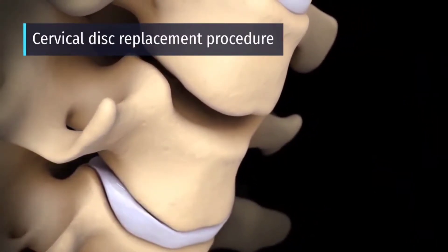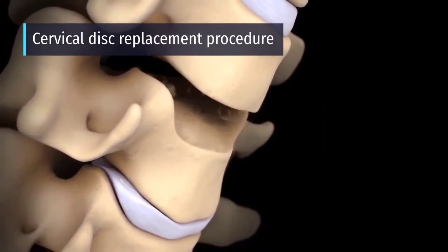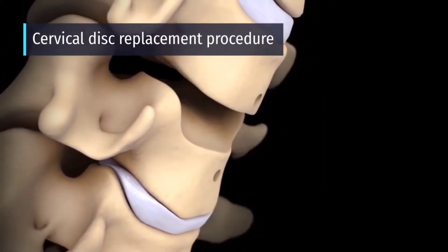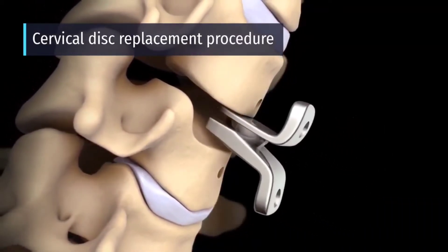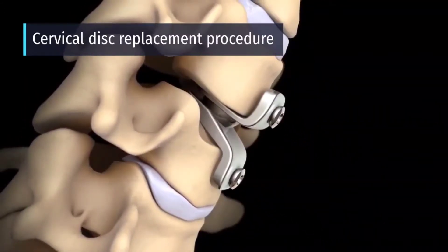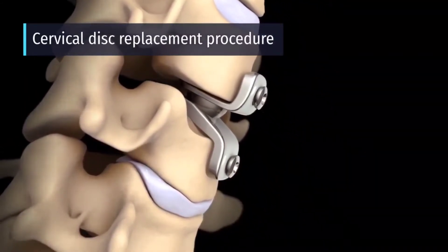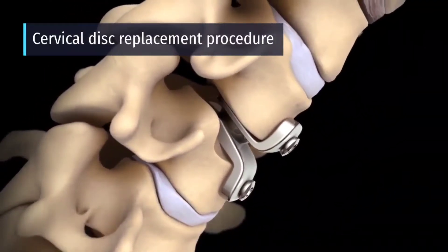The vertebral bodies above and below the removed disc will be trimmed to allow placement of an artificial disc. Finally, your surgeon will insert the artificial disc, which may be held in place with screws. The artificial disc is designed to preserve normal motion at this level of your spine.